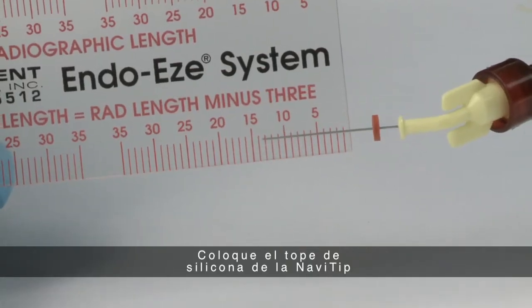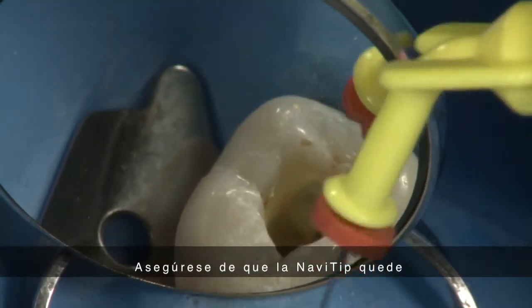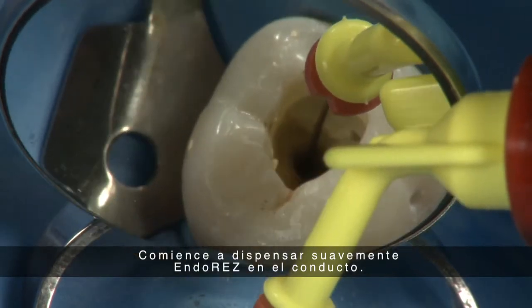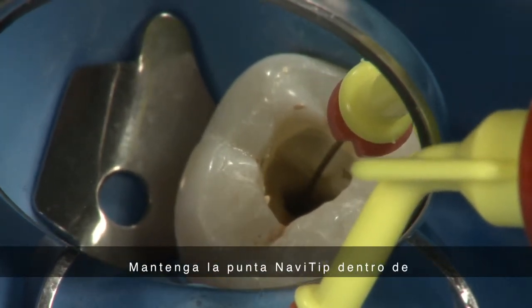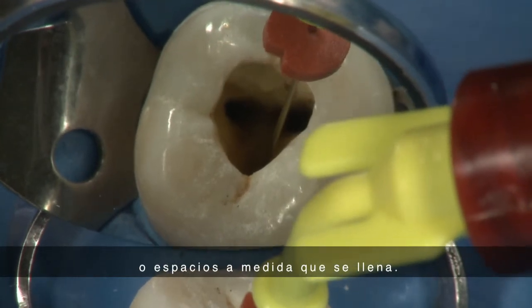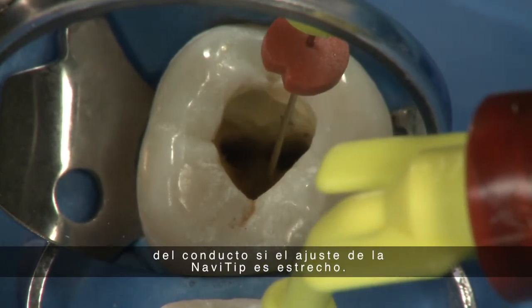Set the Navi tip silicone stopper 2 to 3 millimeters short of the working length. Be sure the Navi tip remains 2 to 3 millimeters shy of the apex and does not bind. Begin gently expressing EndoREZ into the canal. Do not force the material out. Keep the tip of the Navi tip buried in EndoREZ as you backfill the canal to eliminate the formation of air bubbles or voids as the canal fills. Caution: do not deliver EndoREZ into the canal if the Navi tip fit is tight.